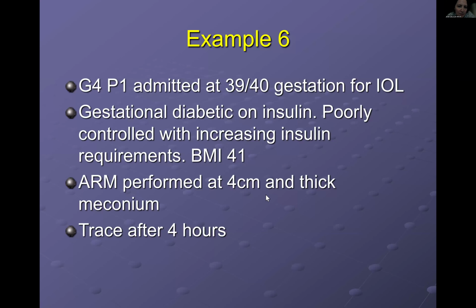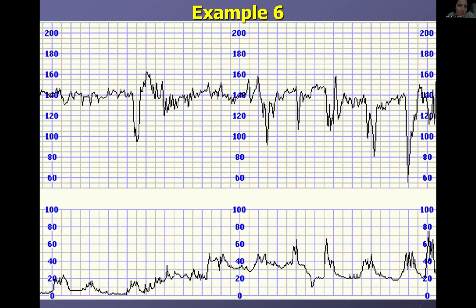She's been last examined 4 hours ago. She definitely needs to be examined. And unless she is fully dilated and ready to start pushing and you go to expedite delivery, you have to consider cesarean. Now, of course, doing cesarean is also a bit tricky because of her BMI. So in the ideal situation, she's fully dilated and you expedite delivery. If she's not, there's an increased risk of losing the baby, basically. Yes. Very good.